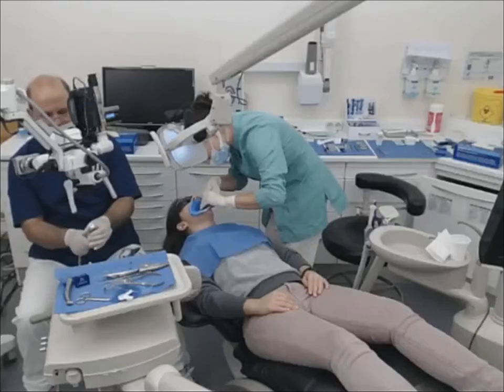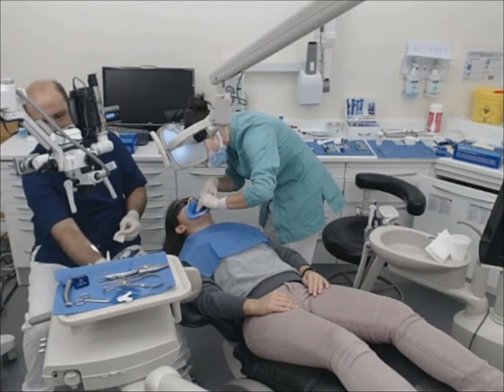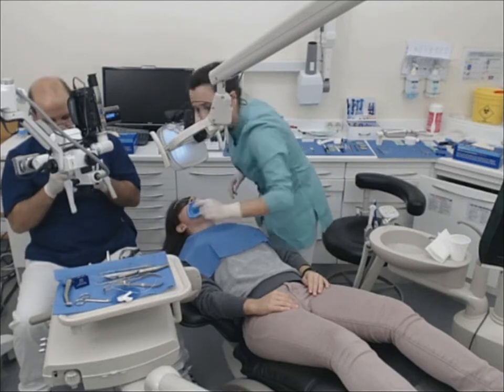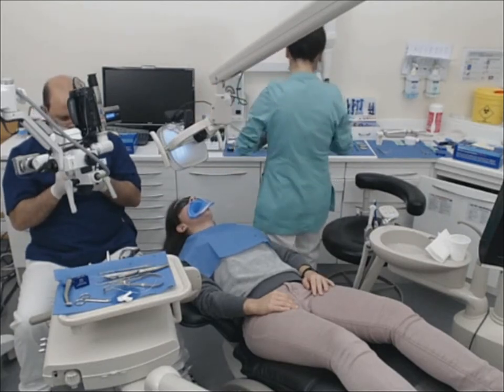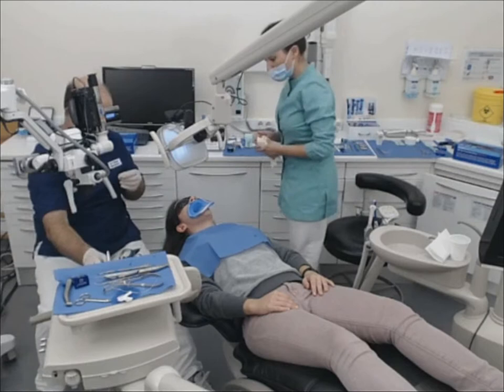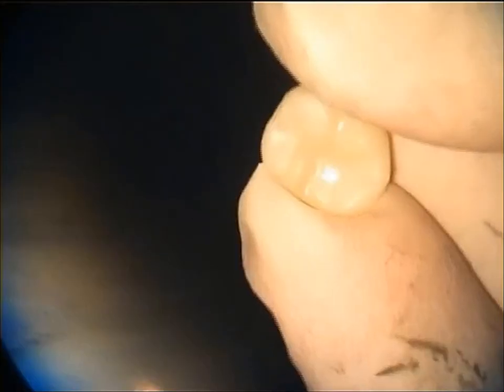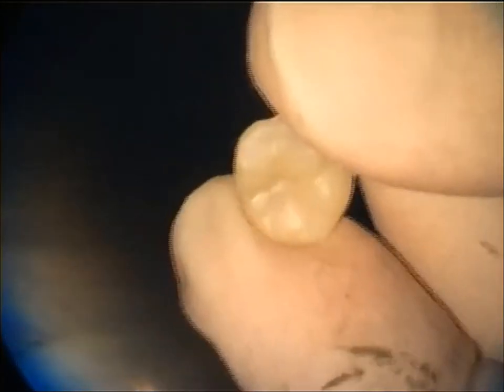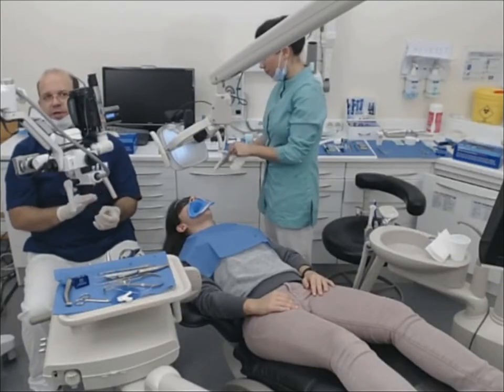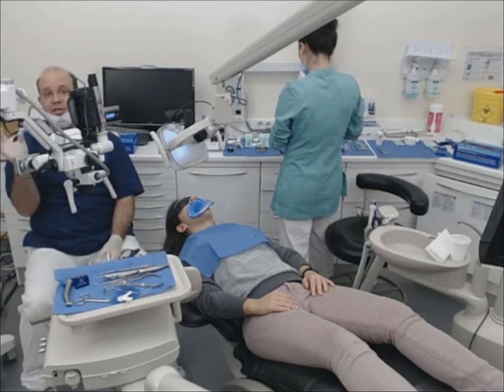I'm just gonna clean the surface with the gauze. Okay, just gonna clean with the gauze. And you can see the smoothness of the surface. Okay, so at this time we have two options. We can just cement, of course you have to prepare the inner surface for the adhesion, but you can cement this restoration, or you can add some tints, some characterization, some individualization.